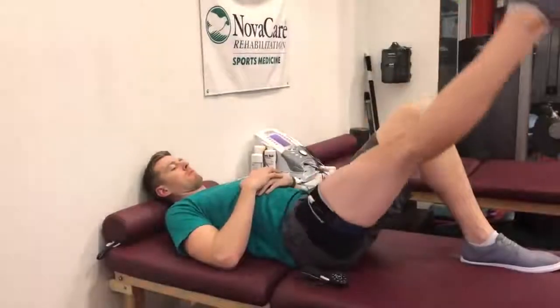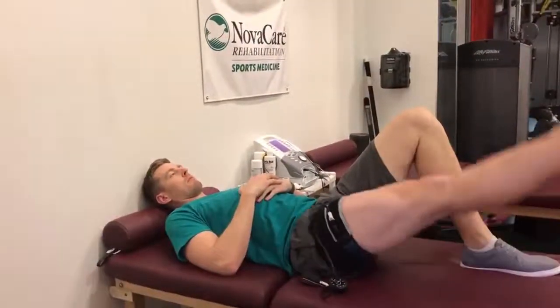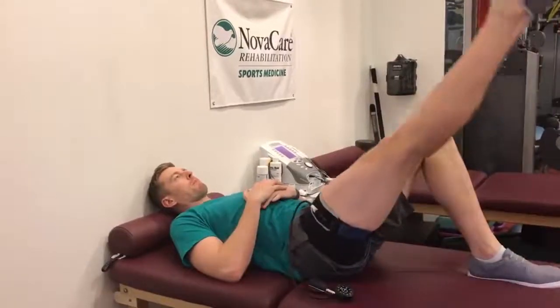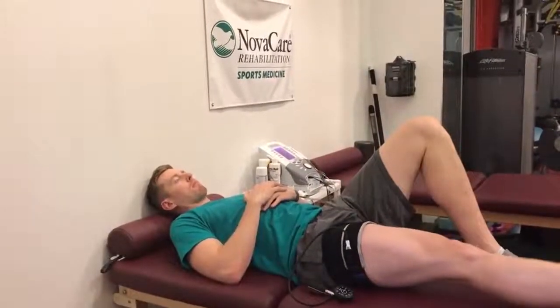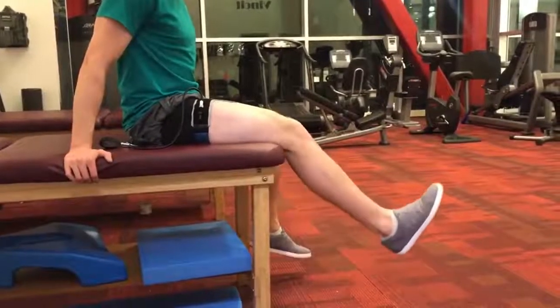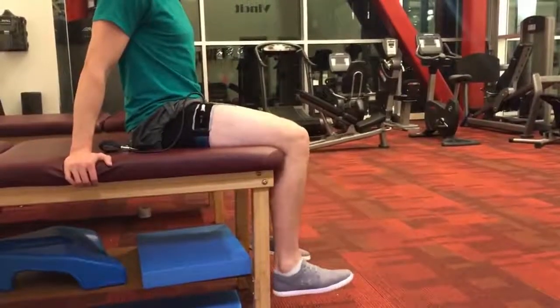We can begin by using BFR along with NMES, as discussed in our previous video. This has been shown to enhance muscle hypertrophy as well as strength gains greater than with NMES alone. We can also progress to using BFR with a straight leg raise as well as isotonic exercises off the table in order to make strength gains while following our post-op precautions.